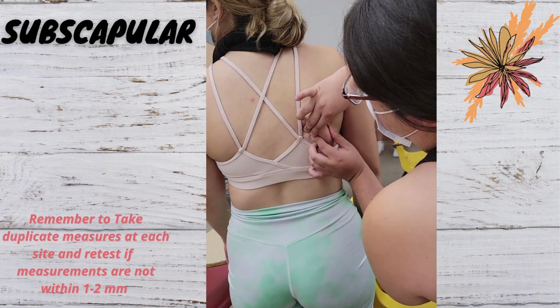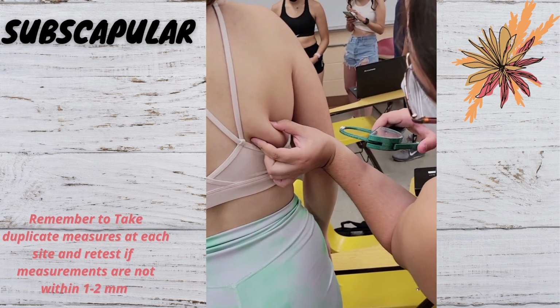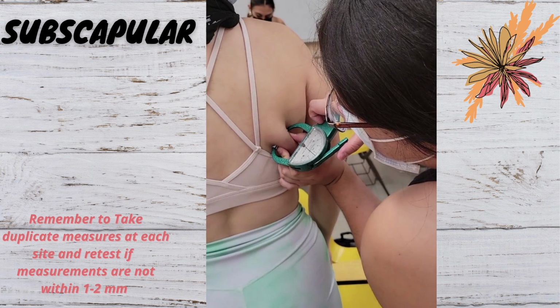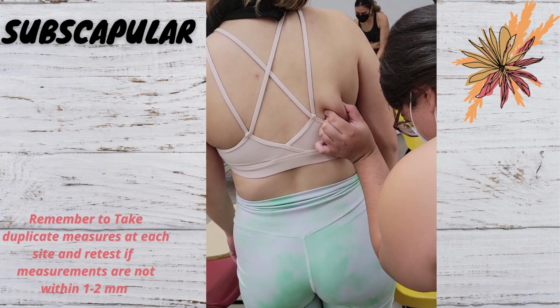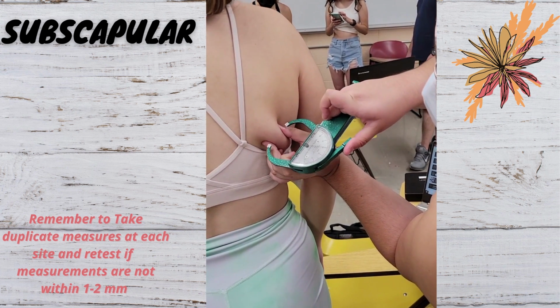When taking the right subscapular measurement, you're going to pinch a diagonal fold 1 to 2 centimeters below the shoulder blade, or the inferior angle of the scapula. Use the skinfold caliper and pinch the diagonal fold, hold for 1 to 2 seconds, and then record your measurement.